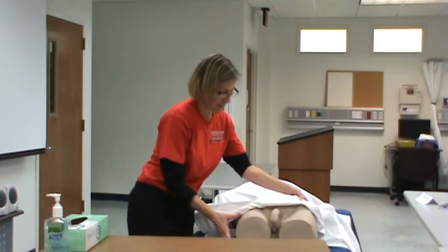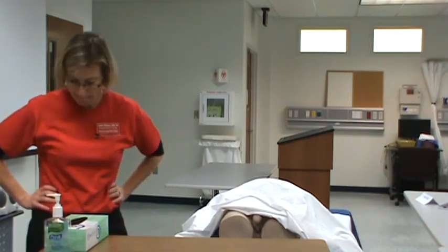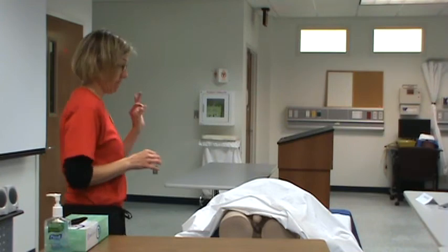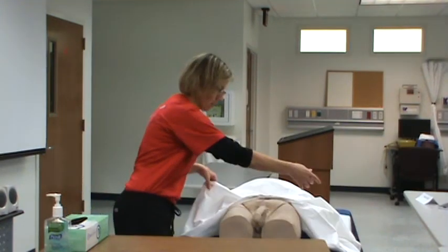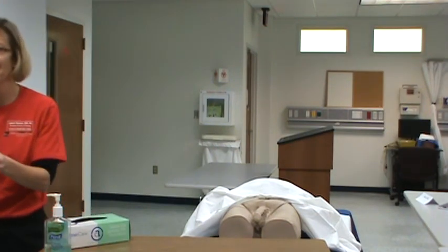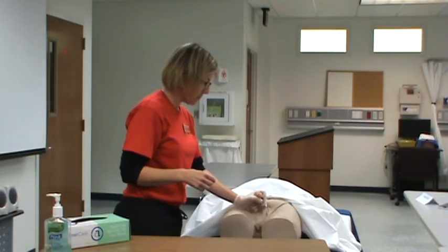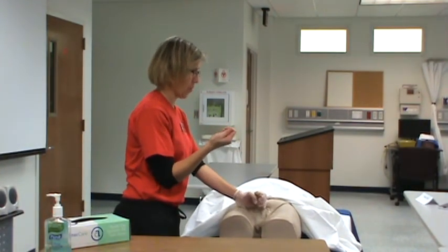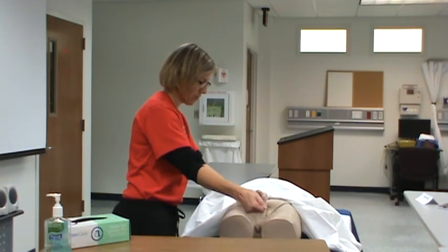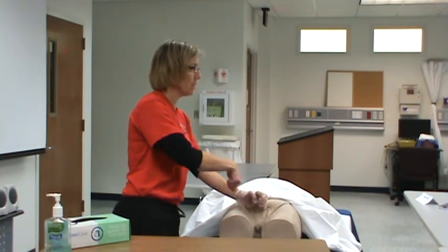Let's see, since I'm not gonna get out a whole other kit for our guy, I can simulate because the video showed it very well. I'll at least put on gloves because I think that's the right thing to do. I need one more glove if you don't mind. When cleansing the meatus, the video showed it great. From the inner to the outer, take your other Q-tip and keep on going, and then take your other Q-tip and keep on going. But you start at the middle and work your way out.